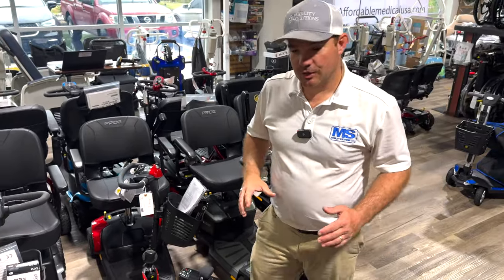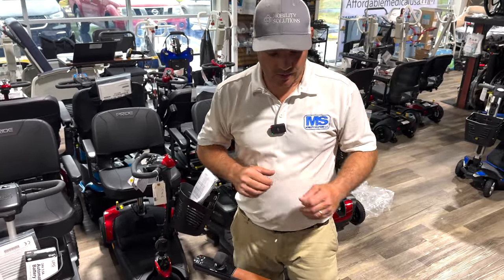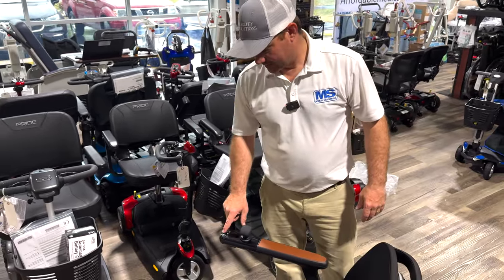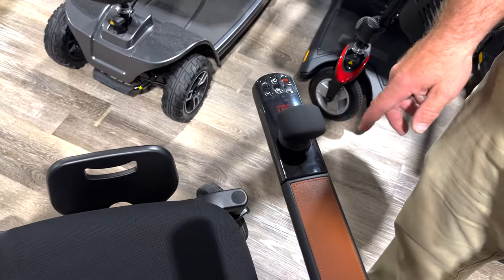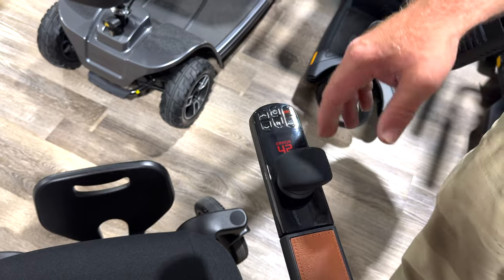So I'm going to turn this unit on, and it's going to talk to you, telling you what's wrong with it. So I'm going to leave this in freewheel, because that's very common for something that might happen. I'm going to press this on button. Hold it down a little bit. Brake open. So it's giving me an error code. Now in your manual, I'll tell you what these error codes are, but it said brakes open.